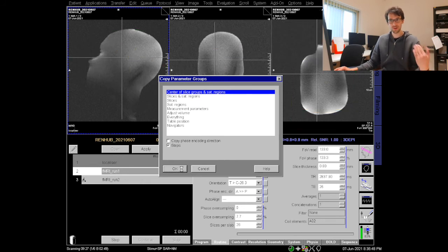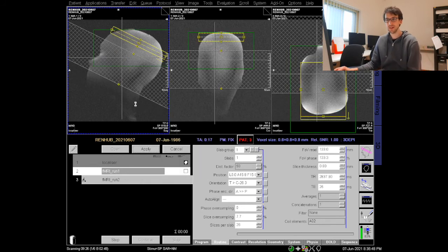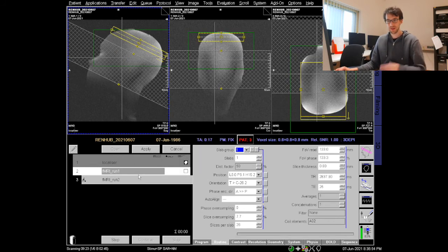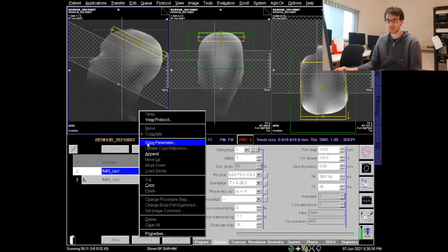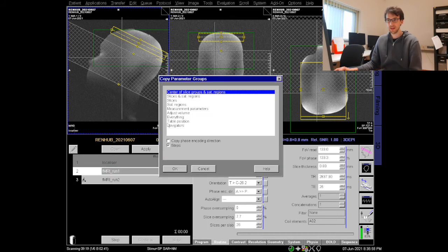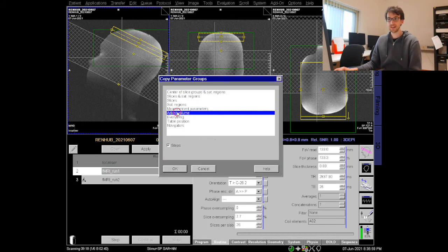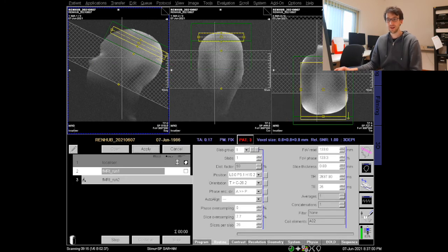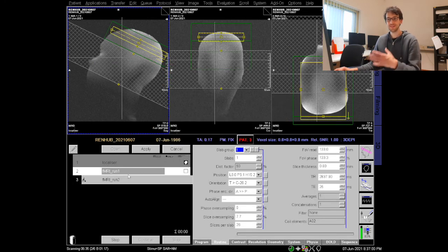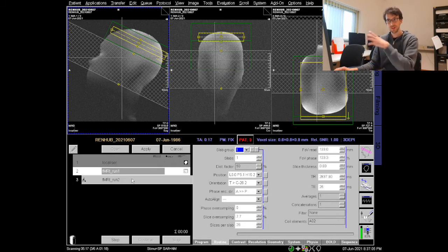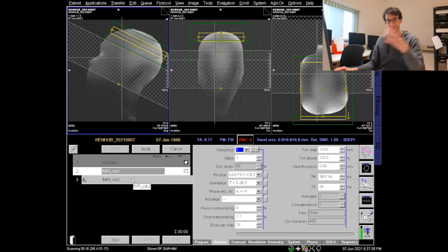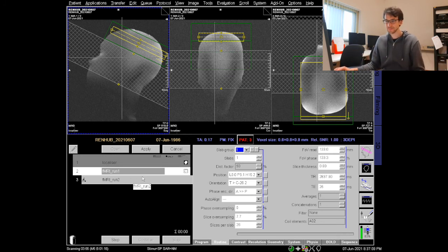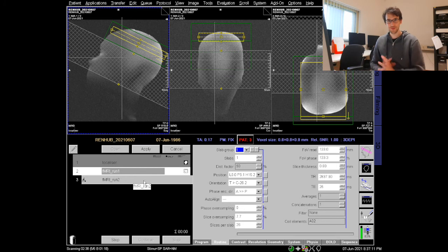First I copied the center of slice groups so we might want to have the same orientation of our imaging volume but now I also want to have the same shim current. So what I do is I copy parameter and select adjust volume. Okay, so now the second run will use the same shimming also including the third order shim as the first run.